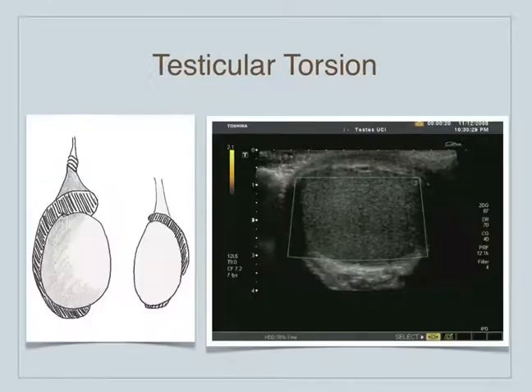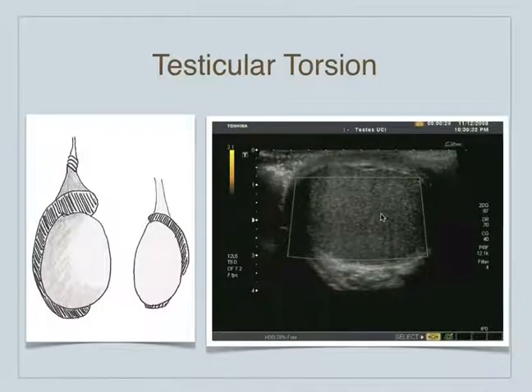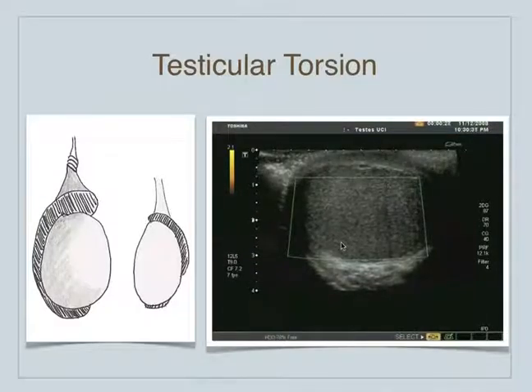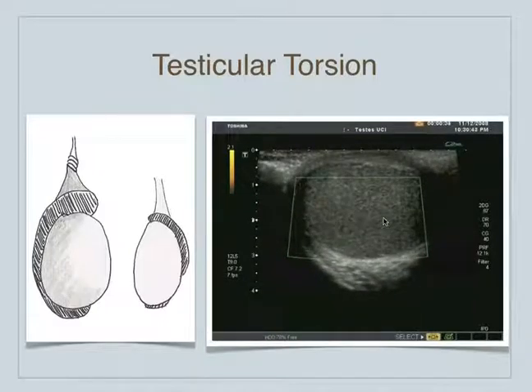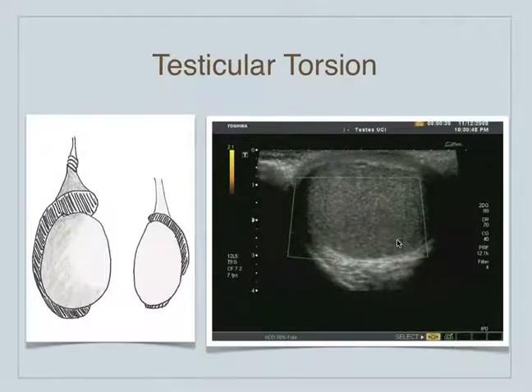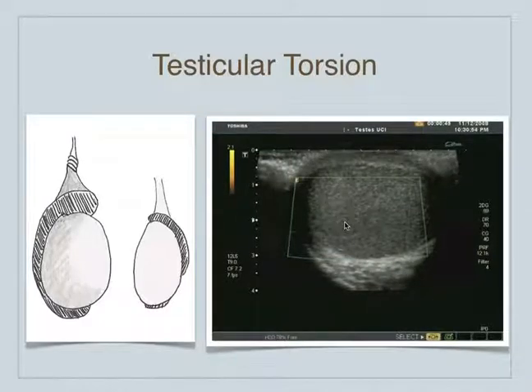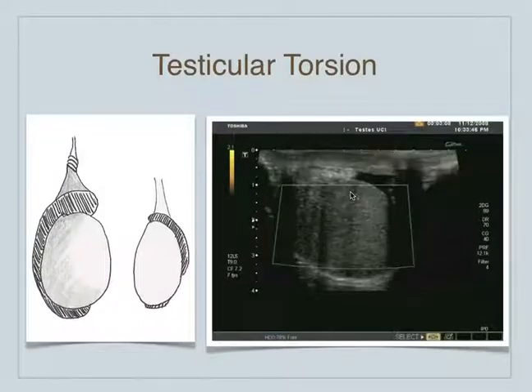This is a patient with power flow Doppler on, and we are assessing this testicle for flow. There's no flow to this testicle, and in fact if you looked at the other testicle, this is hypoechoic compared to the other side. No matter what we're doing with our settings, we can't get any flow to appear to this testicle as opposed to the other side. Indeed, this patient did have testicular torsion.